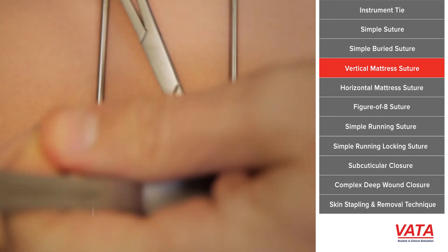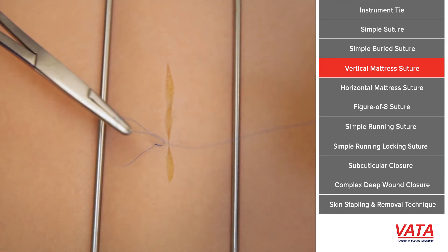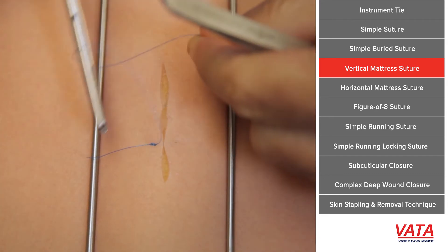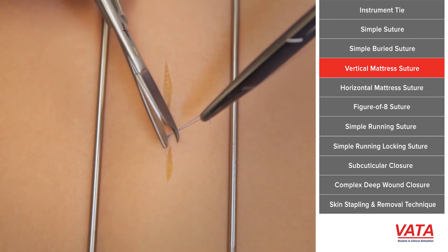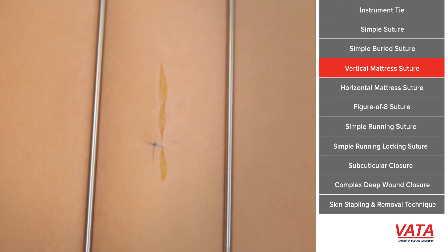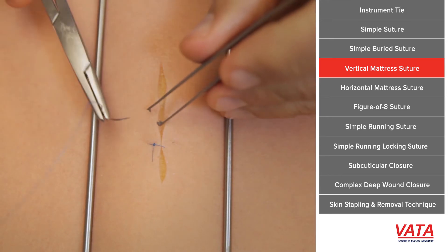And again, you do your instrument tie and generally I'll pull it tight just so I see the skin kissing. This is a more secure closure because now what you're doing is actually grabbing a bunch of tissue and a bunch of tissue, pulling the skin edges together but there's no actual stitch in the actual edge of the skin.